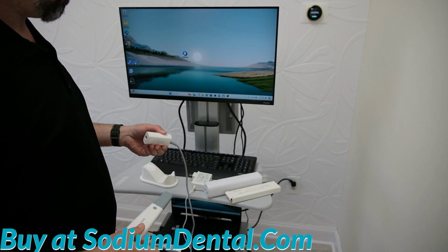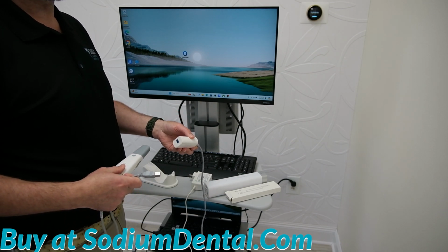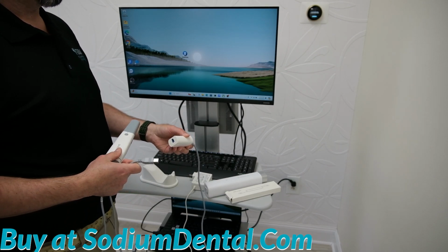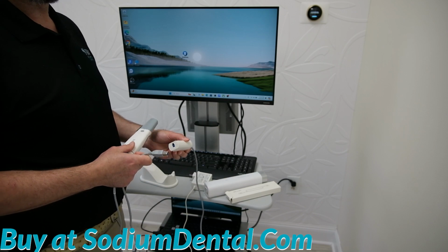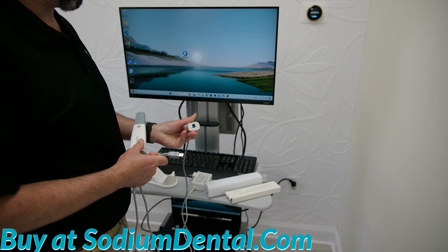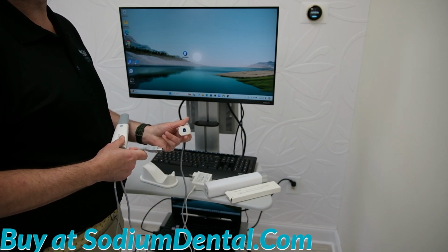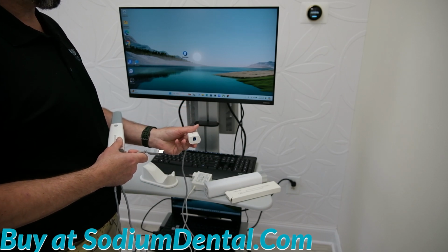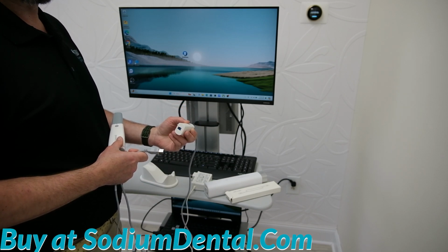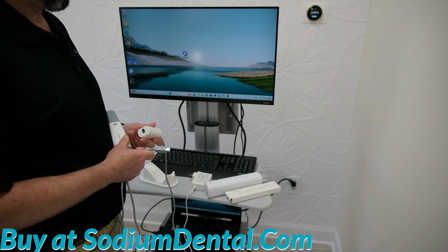Instead, it plugs into this device, which applies the appropriate amount of power necessary for the intraoral scanner without relying on the power coming out of a USB port on a computer, which is often dirty power out of the computer and can damage high-end electronic devices. So Shining uses a power inverter.